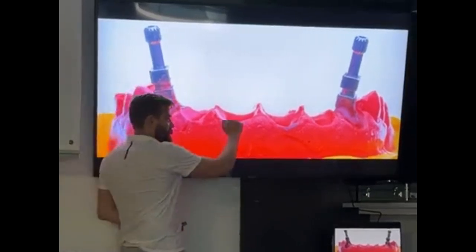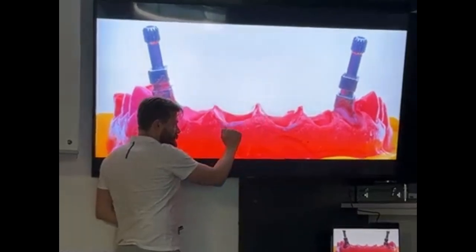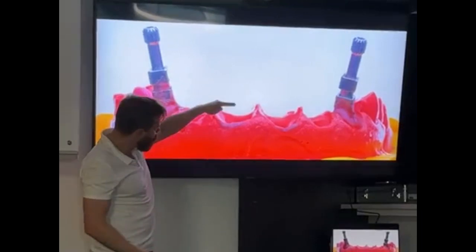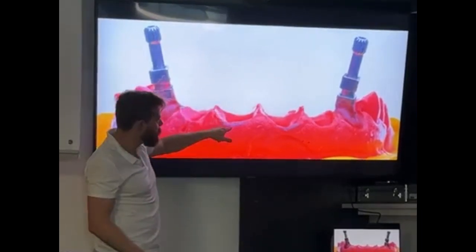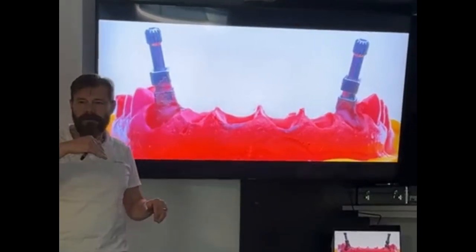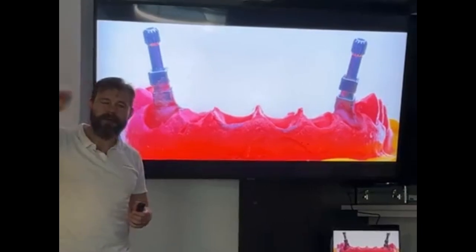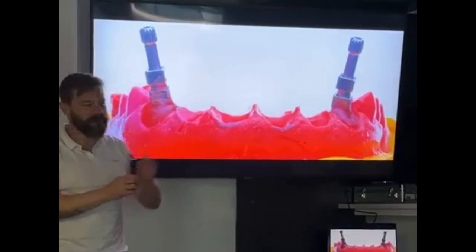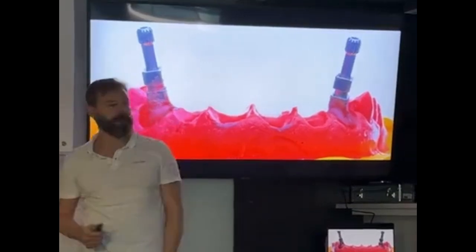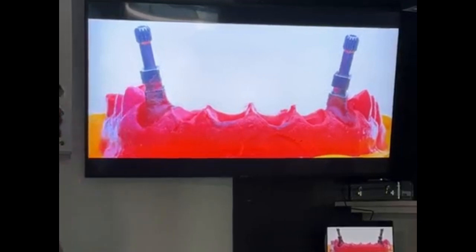I'm going to bring the sealing zone or the critical area straight down as we discussed last day, and from this vertical modification of the gingiva, how is the shape inside the socket, the transition zone: concave, as concave as possible without being retentive, which is going to give you more or less 45 degrees of inclination, right? So let's look here how we modify the cast.